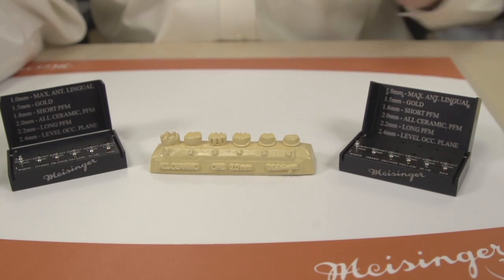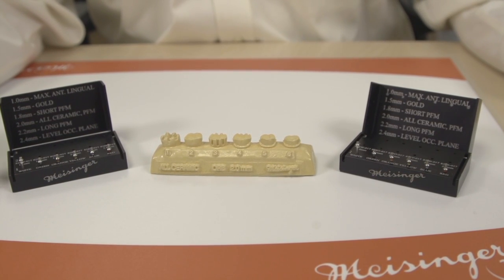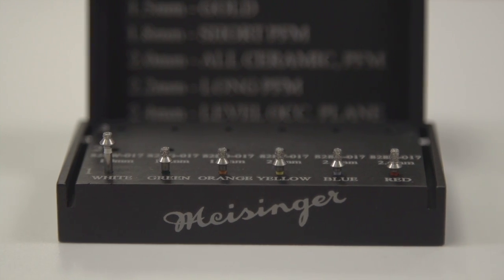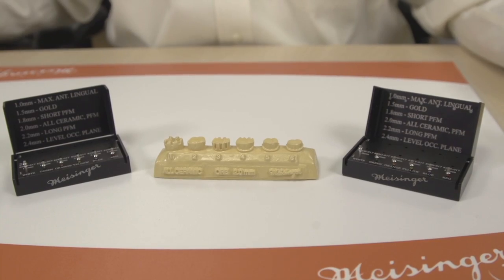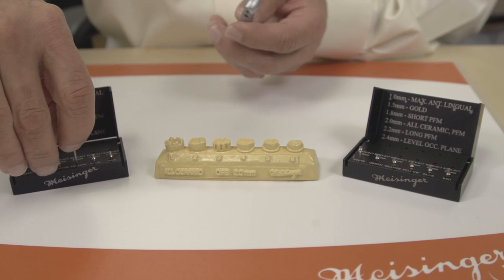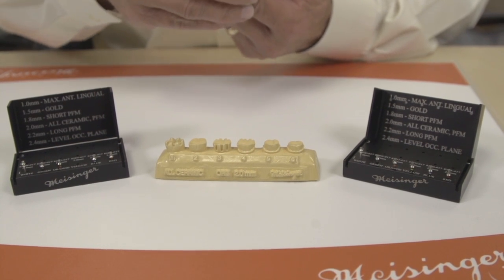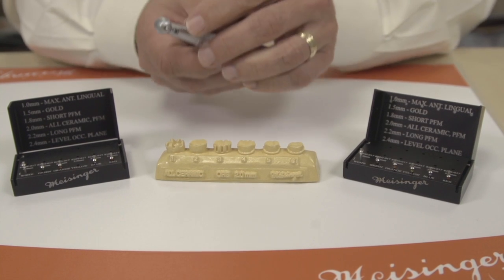With this kit, we have a series of depth-cutters from 1mm up to 2.4mm, depending on the materials as well as the access that you're looking for. We're going to start today with a 2.0, which is the number one selling depth-reduction diamond of all of them.